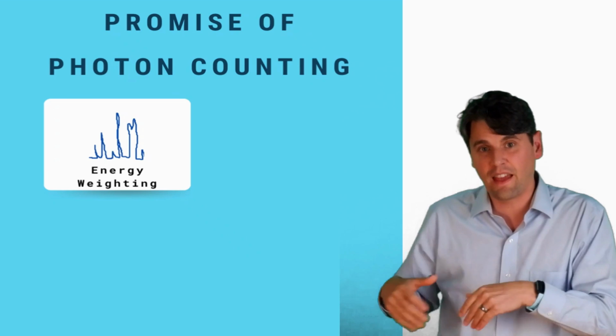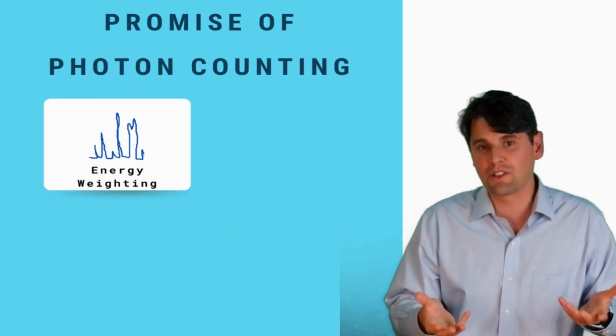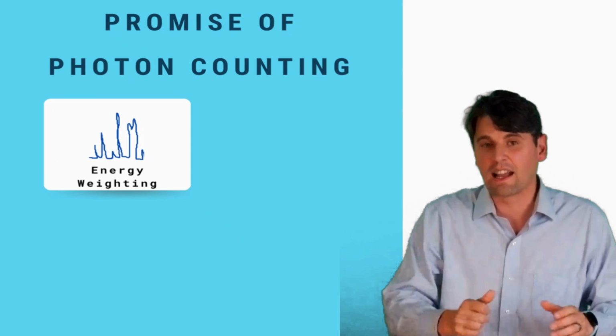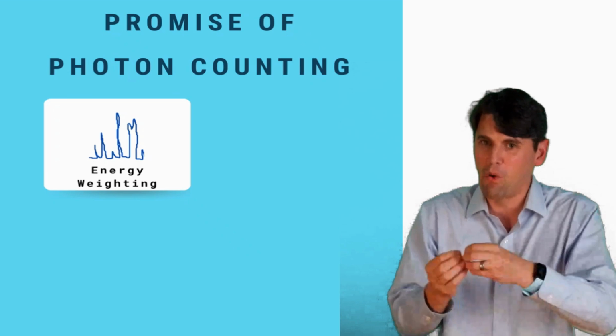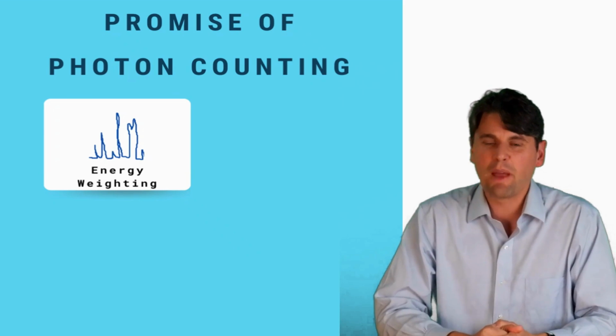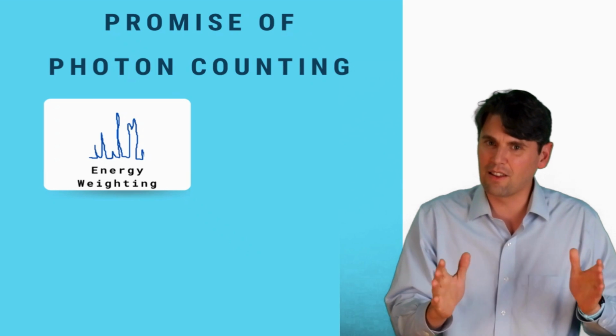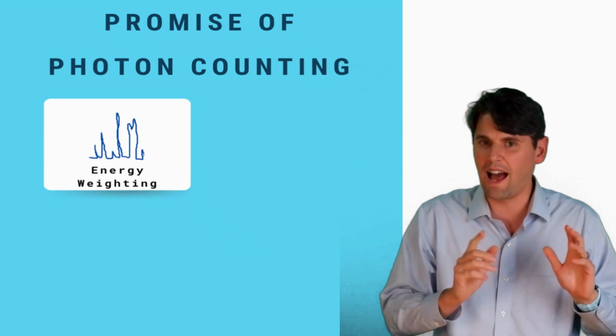That's different from our energy integrating detector, wherein the high energy X-rays got measured with a bigger weight because they were making more actual visible photons that were getting measured. And we actually like the contrast a little bit better at lower energies, especially for bone and iodine imaging.